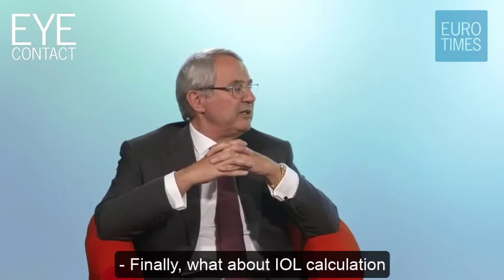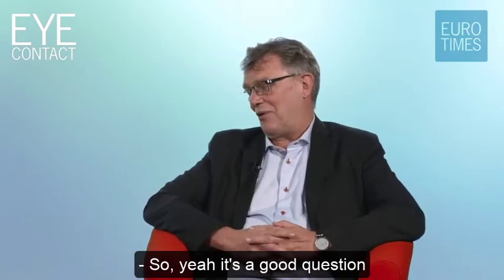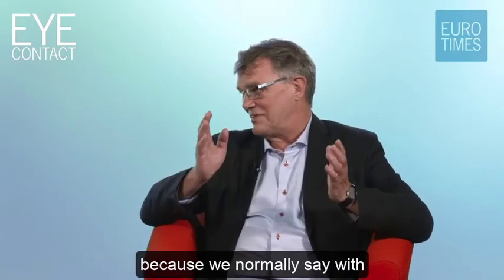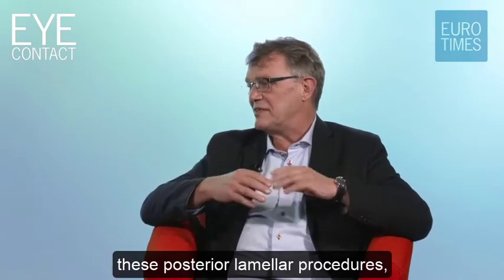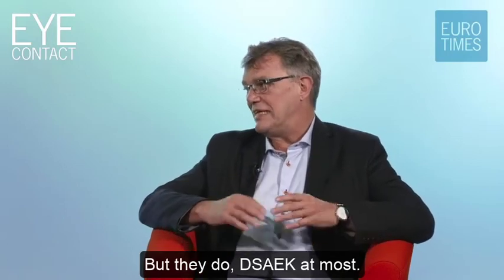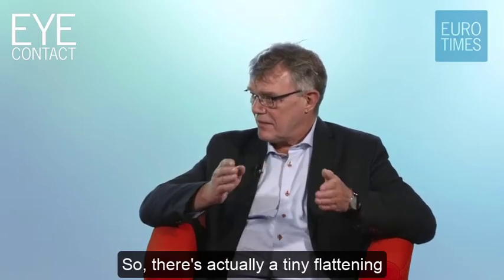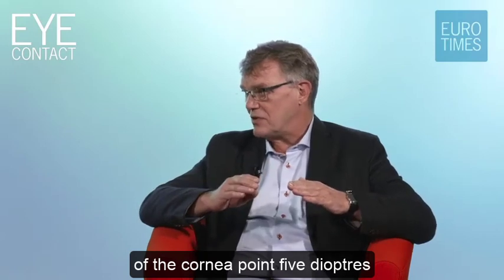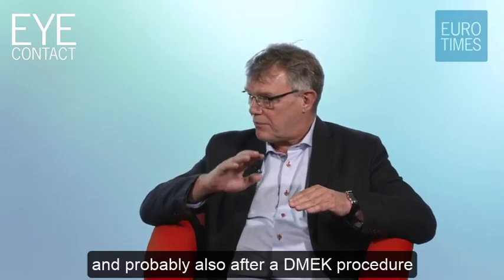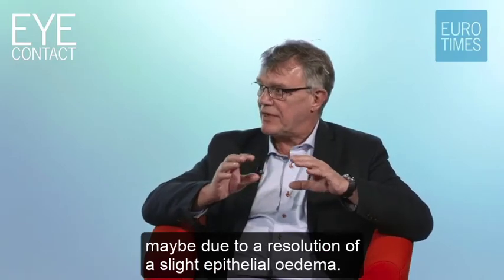Finally, what about IOL calculation when you perform combined procedures? Yeah. So it's a good question, because we normally say, oh, these posterior lamellar procedures, they do not influence the refractive power of the cornea, but they do. DSEK at most. We did a study a few years ago where we measured corneal anterior power before surgery and also after. So there is actually a tiny flattening of the cornea, 0.5 diopters, after a DSEK procedure, and probably also after a DMEK procedure, maybe due to a resolution of a slight epithelial edema.